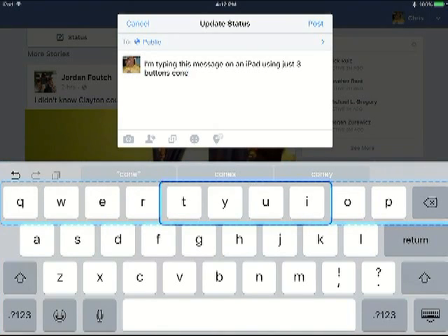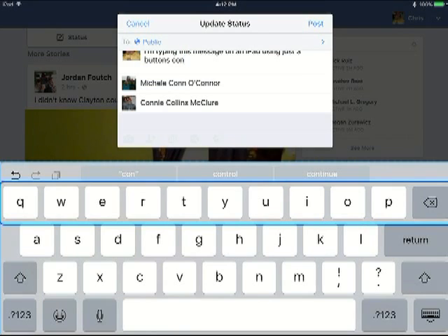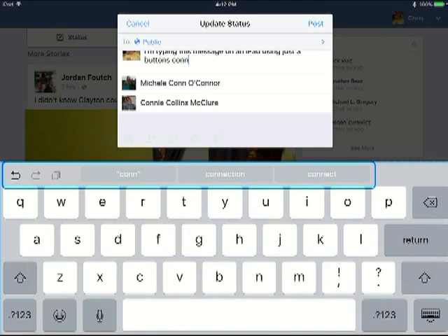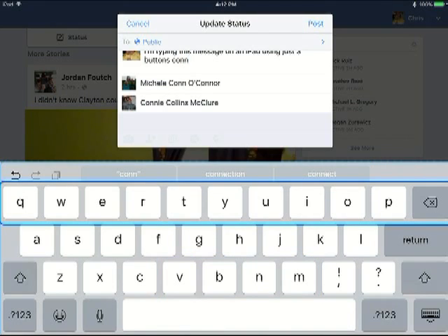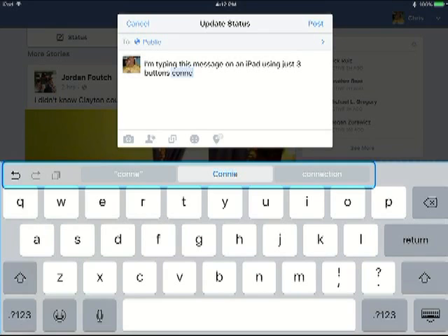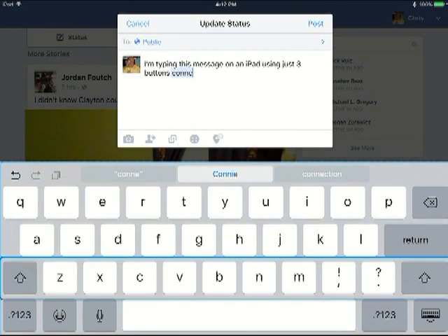I've only been using this feature about an hour or two, so my scanning skills aren't very good yet. This is very similar to a program I wrote back in 1981 called VersaScan. It ran on an old 8-bit computer running the CP/M operating system. A friend of mine would use a clicking sound with his tongue to activate it. He wasn't able to use push buttons like I can.